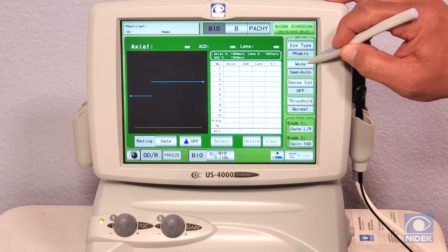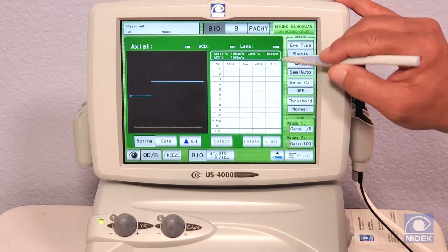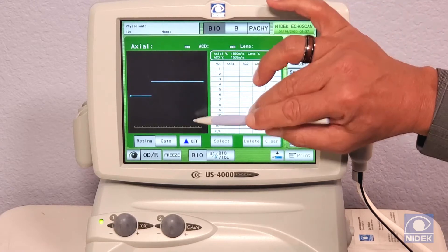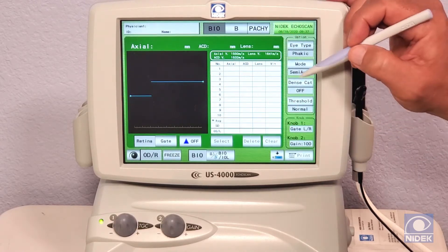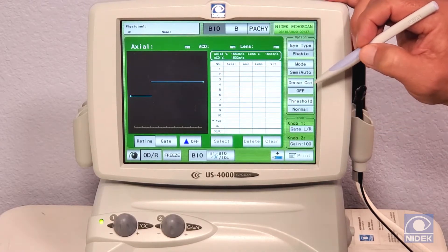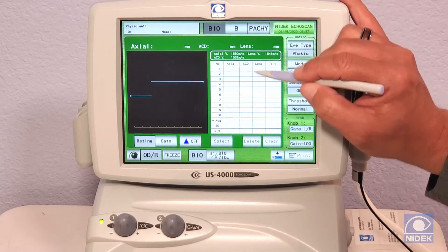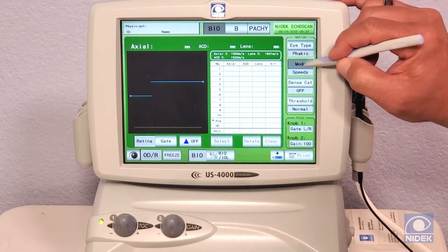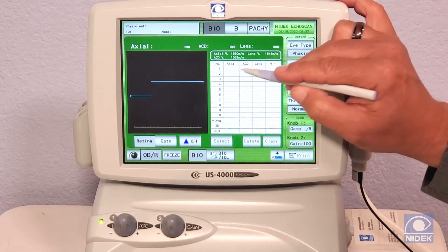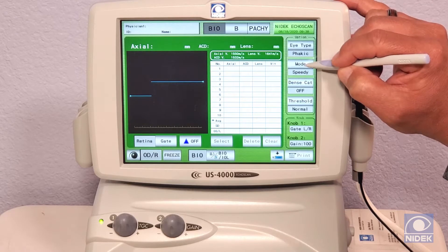For modes, we have semi-auto mode, which once the waveform hits the threshold, you can press the foot pedal and it will measure 10 measurements automatically. Speedy is going to give you three measurements automatically.